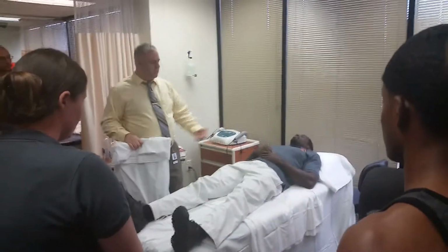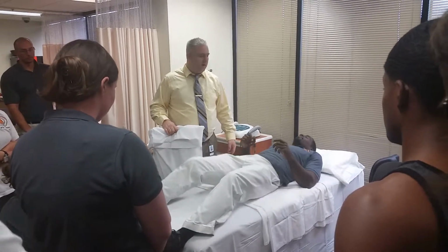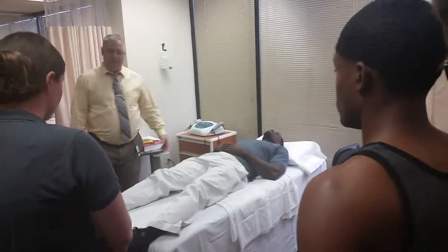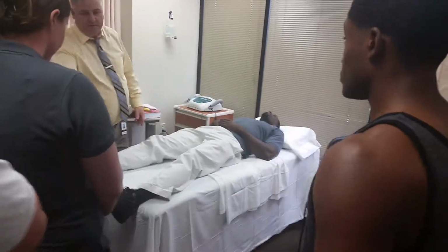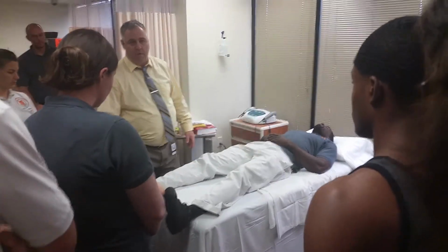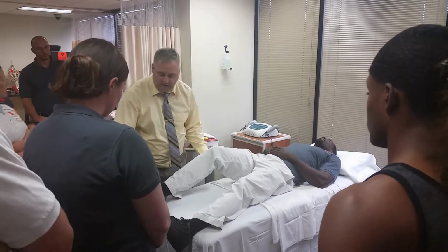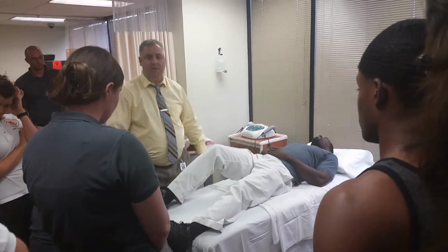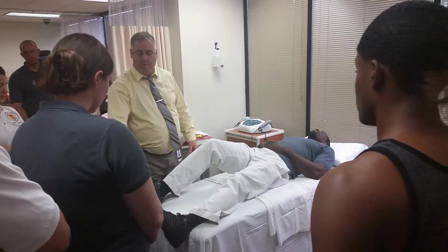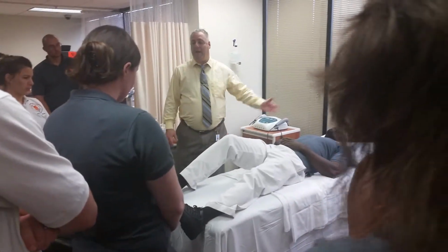And then just pretend that you have scooted down a little bit. Keep going. All right, and relax. So we come into the patient's room, and the patient has slid down, and pretend there's a footboard here, and the person's feet are against the board, and he's as tall as he is, so he has to bend his knee. So he's in this position. Now we have pressure with his foot against the footboard, plus his knees in a bad position. So we have to get him back up in bed.